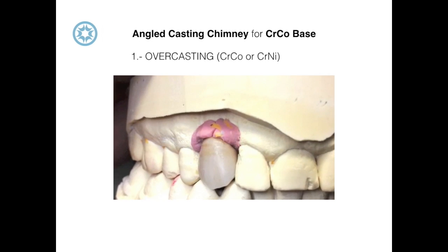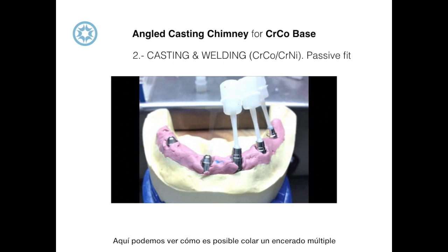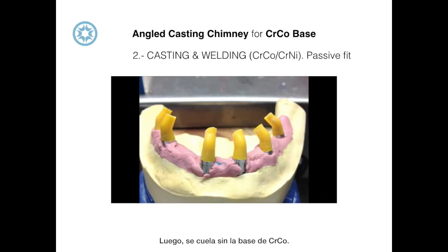Here we are able to see how it's possible to cast a multiple restoration using the angled casting chimney. First, the angled chimney is waxed up, then it is cast without the cobalt chromium base.